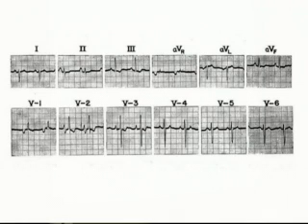Now I'll ask you, is there evidence of atrial enlargement on this ECG? I go to lead 2, I've got a very tall P wave. It's almost 4 boxes tall. That suggests right atrial enlargement. Come down here to V1, I've got deep terminal negative deflection here. Very deep and wide, evidence of left atrial enlargement. What anatomic diagnosis would fit for this constellation of findings? Left atrial enlargement with right ventricular hypertrophy.